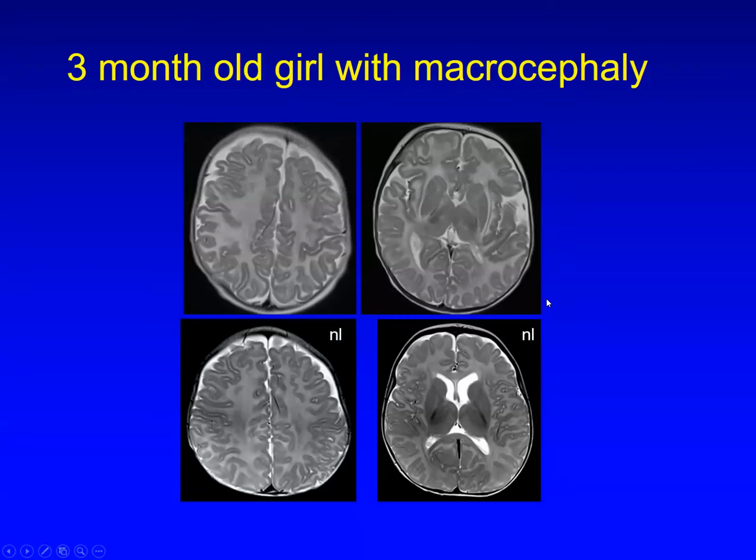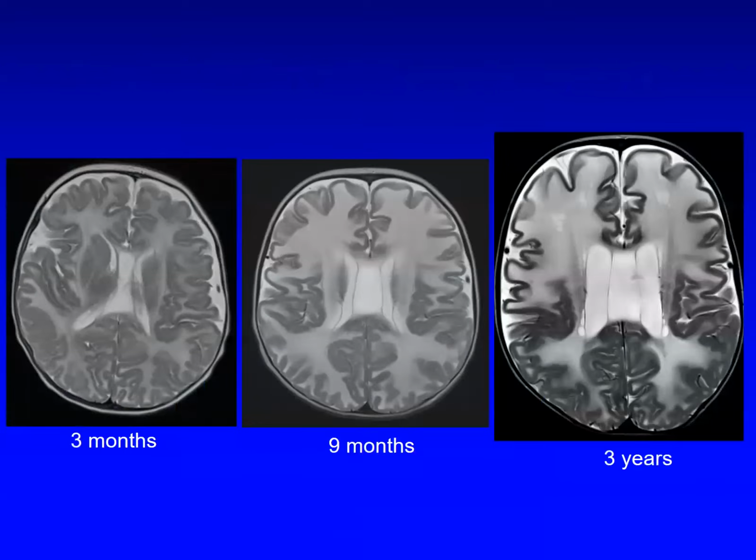Now, it's possible, is this just delayed myelination? Were they a premature infant? Well, if we follow her up a little bit, at 9 months, now we can see that there's really more significant white matter abnormality. So not only is there no myelination in areas that we would expect myelination at this point, but the T2 signal is really too bright. You can kind of see the normal unmyelinated white matter is a little bit grayer. This is really too bright, much brighter than it was previously. Again, there looks like there is some swelling at 9 months here with some gyral expansion, some edema.